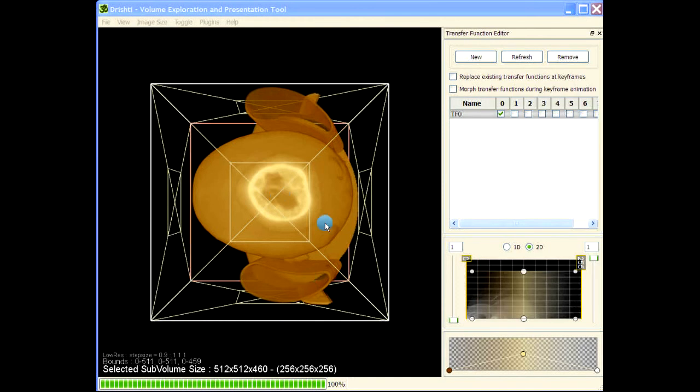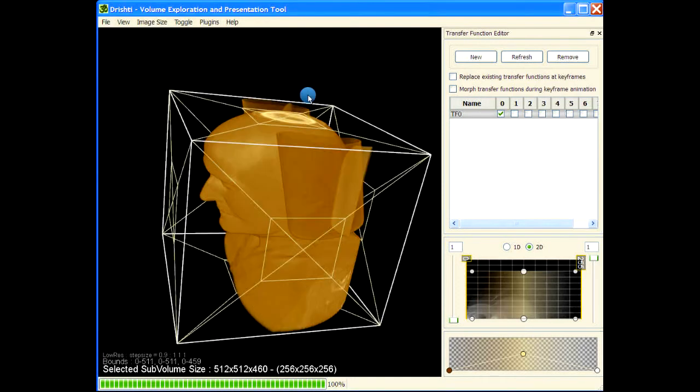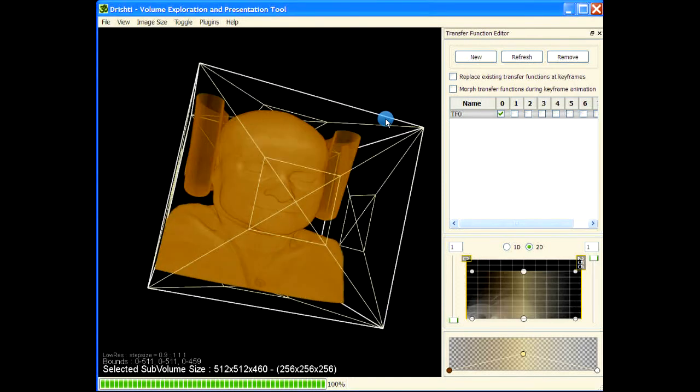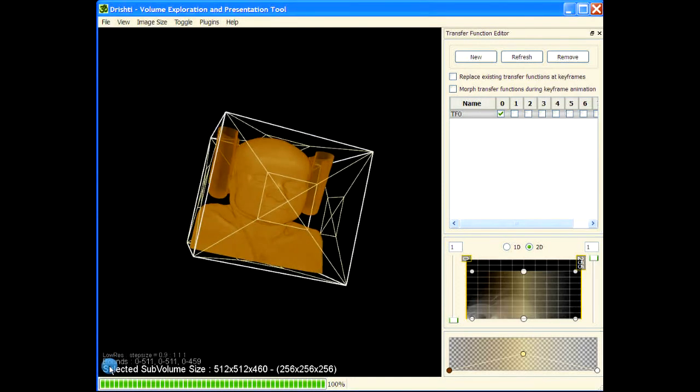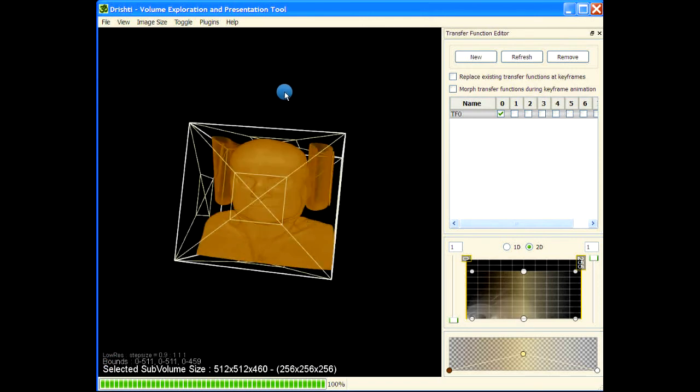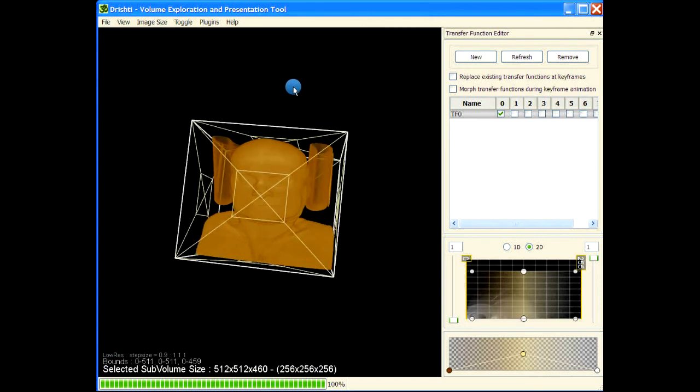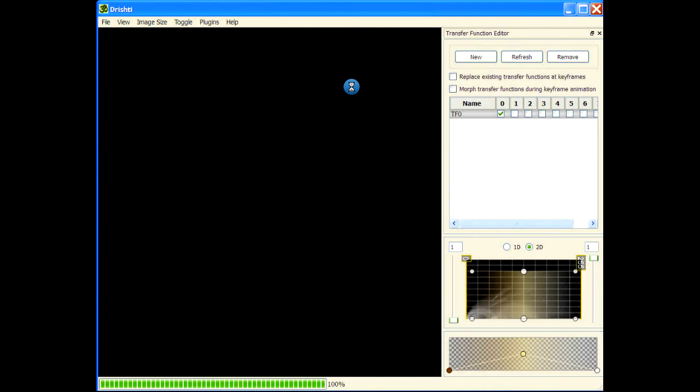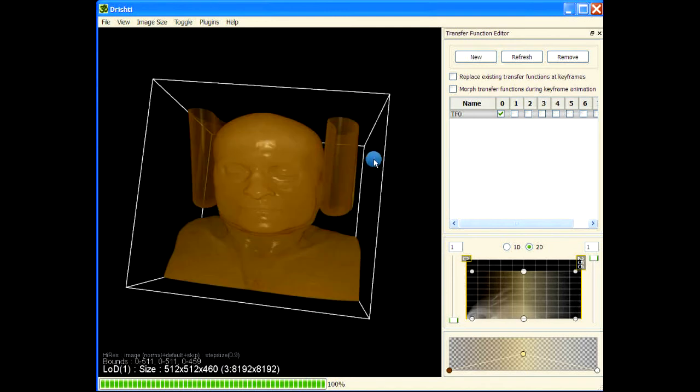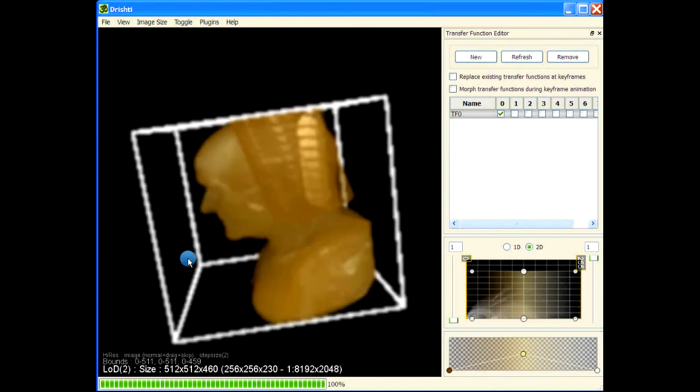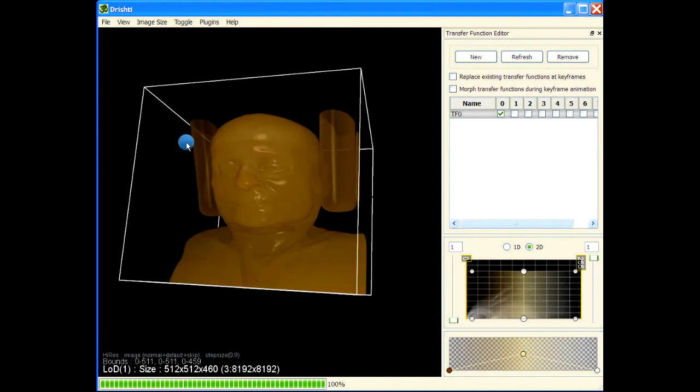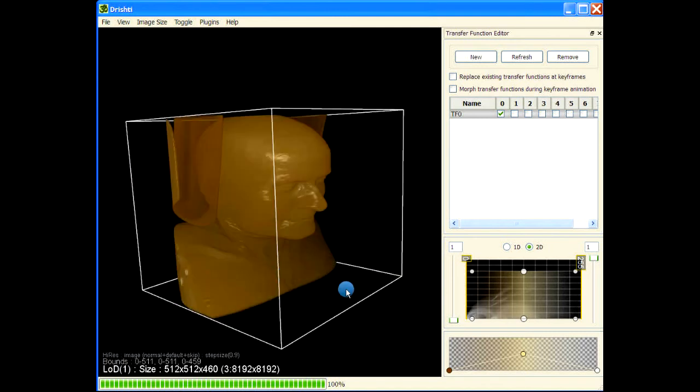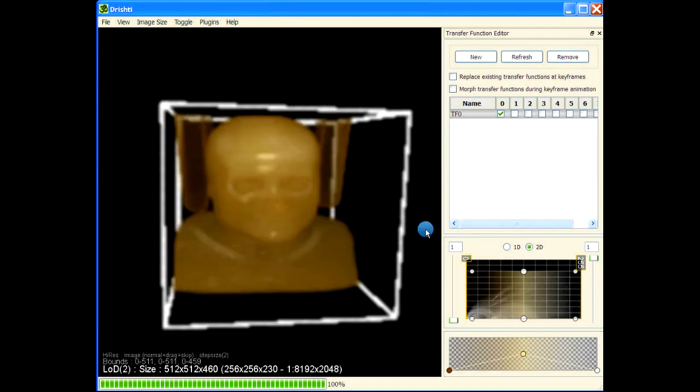And we have our data here. So this is what is called the low resolution mode. And when we press F2 - on Mac it is function and F2, on Windows it is F2 - so press F2 and we go into the high-res mode.